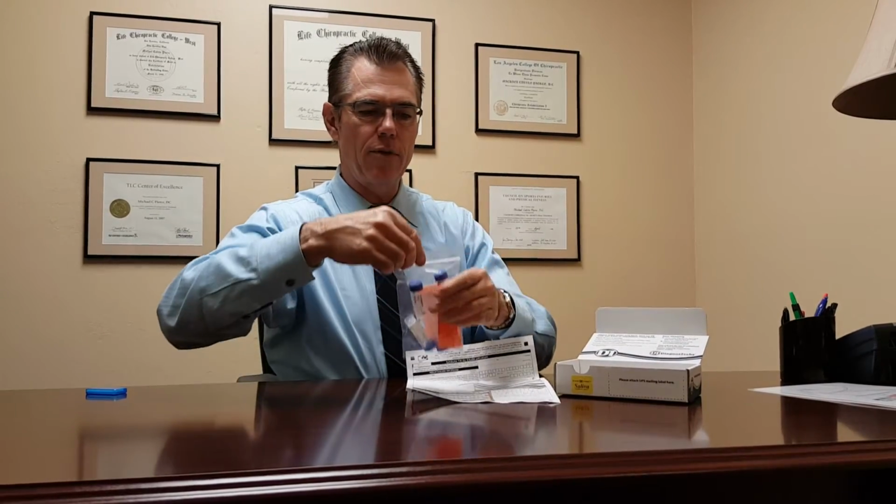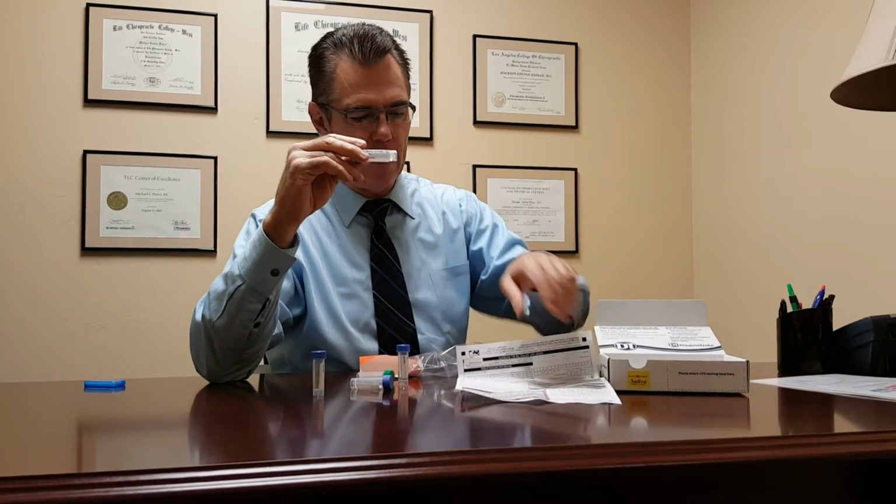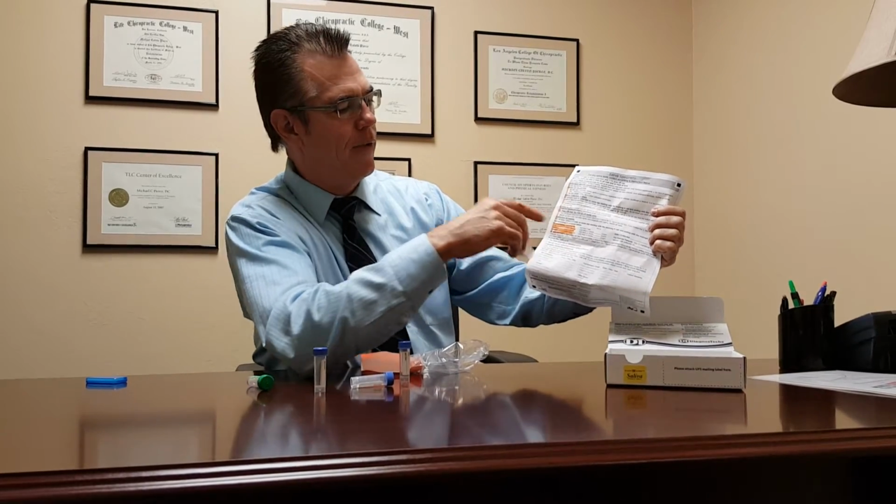The collection samples are going to be done 4 times during the day. The collection samples come in these blue collection kits. You pour them out. You will see that there are 4 of these test kits here. This one you'll start with, it says morning fasting. That means before you eat anything, you can collect this sample. No water or anything, just wake up in the morning. Between 6 and 8 a.m., you will find the collection time on here.